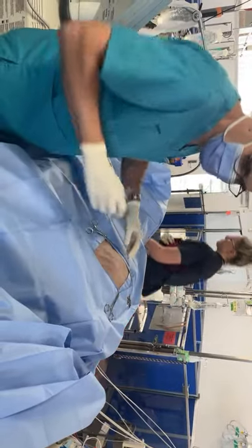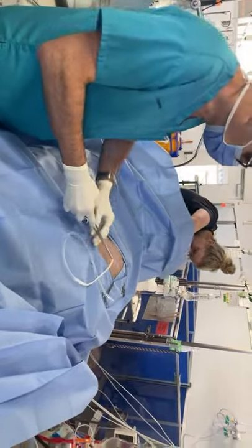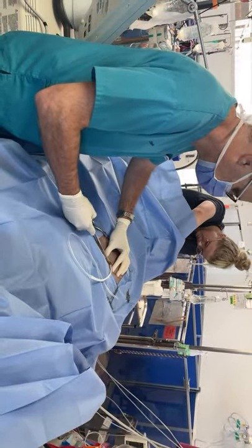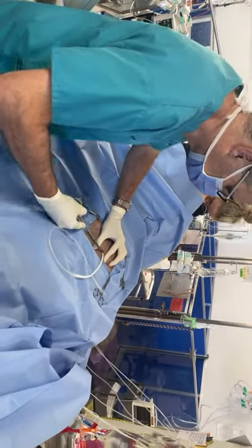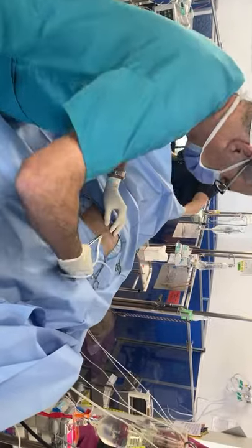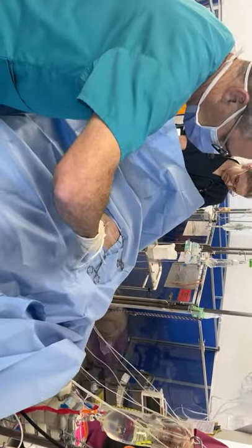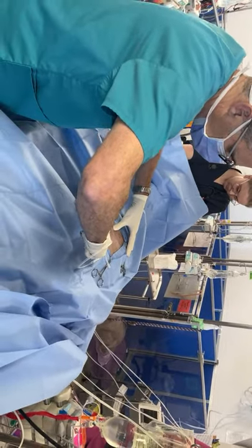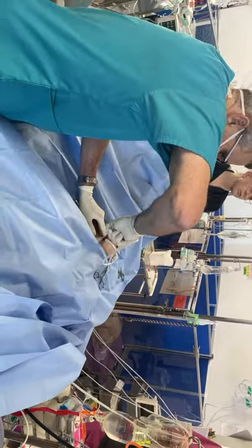Note that these don't always have to be placed surgically — you can place them percutaneously like this. I've made a little skin incision and I'm going in at about the ninth intercostal space, advancing it underneath the skin up about three or four spaces, then turning the right angle 90 degrees to pop through the intercostal space.